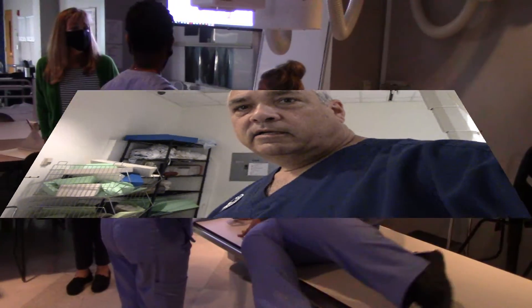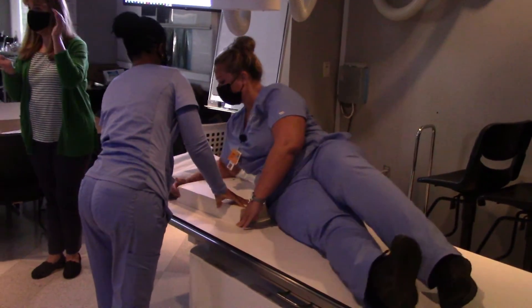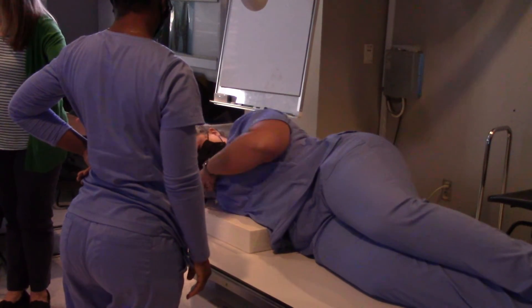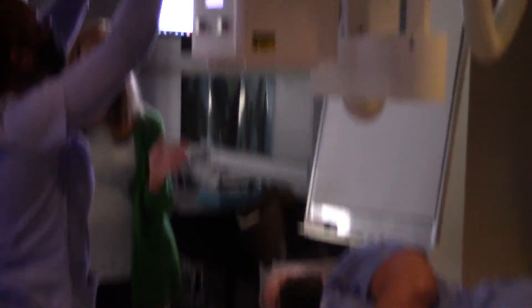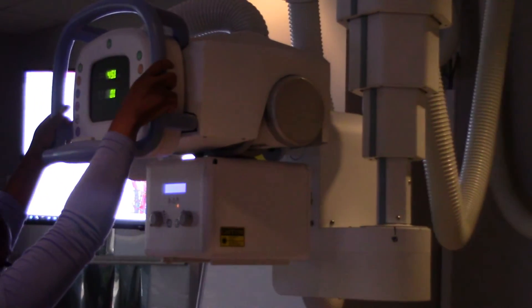We also have our other anthropomorphic phantom that we're going to be using. I'm going to talk to my students for a second and then we'll be back in a few minutes for a demonstration of how to set up some of these x-rays. For the patient, she can roll and put the sponge right under her thorax so everything is in the same plane. We want her mid-sagittal plane to be parallel to the table so that fluids won't run down to the apices.